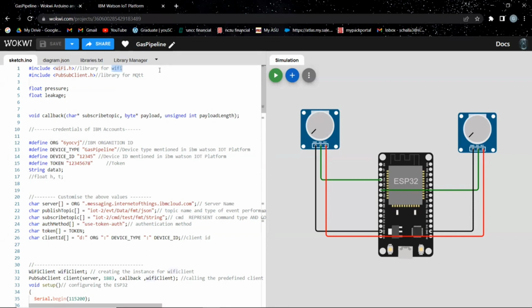To begin coding, we first have to include the libraries that we use in this project. First, we have included a library for Wi-Fi, which is the WiFi.h library. And second, we have included a library for the MQTT protocol, which is a communication protocol. For that, we have used PubSubClient.h.